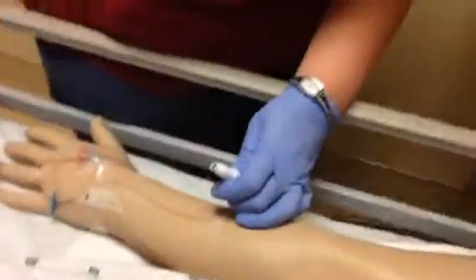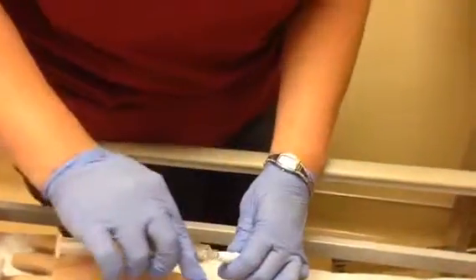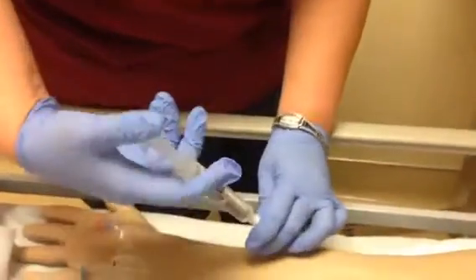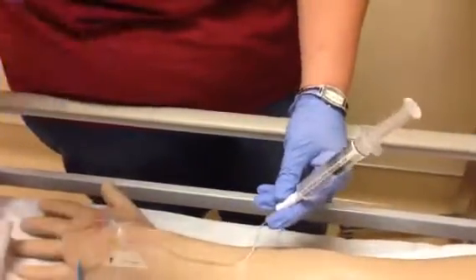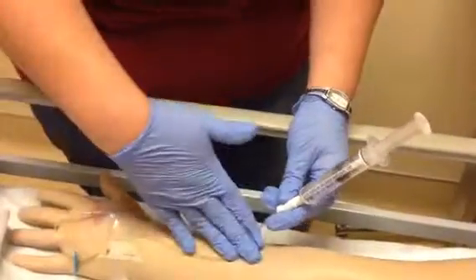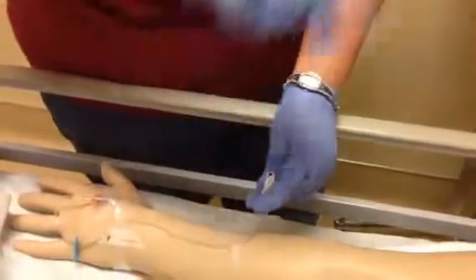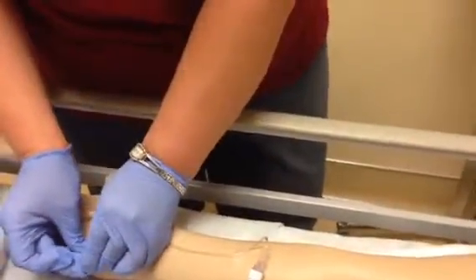If I had touched that port, I'd want to make sure that I cleaned it off. Take my saline, flush with about 3 cc's of saline behind it, and you want to push it at the same rate as you pushed your medicine. So push your medication on through the line. Once you flush behind it, then you would clamp off the saline lock.